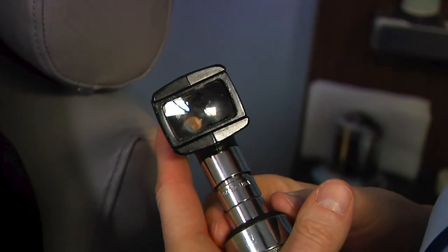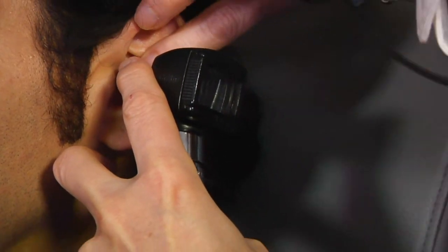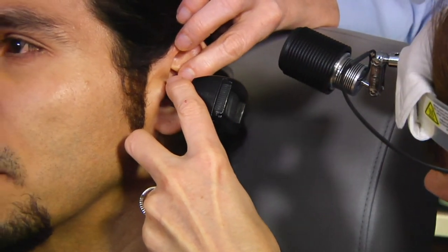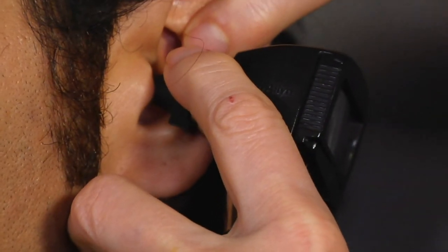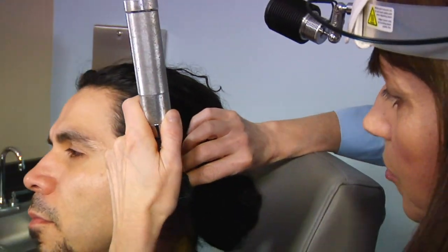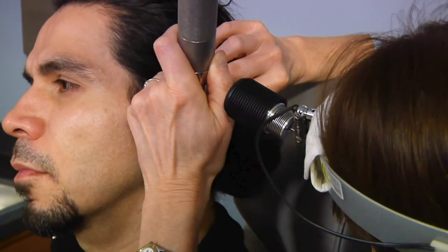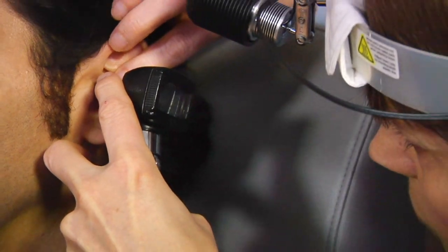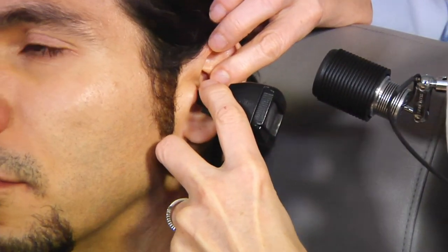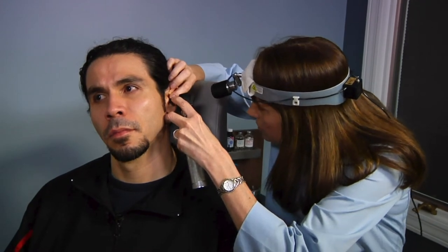In using the otoscope to examine the ear, pull gently posteriorly on the helix — a maneuver that straightens the normally S-shaped canal and allows for better visibility. One should use the largest speculum that the ear canal can accept, as this increases visibility. Another way to hold the otoscope, which is especially helpful in children, is in a rather upside-down position, which gives added stability. It is important to remember that when inserting the speculum, to stay on the cartilaginous canal. As already mentioned, the bony canal is quite sensitive. You need to remove any wax out of the way to better visualize the tympanic membrane.